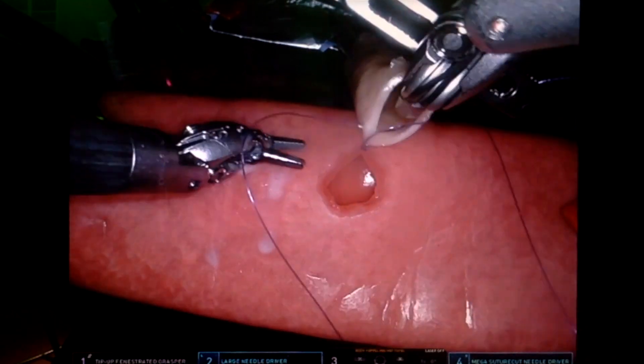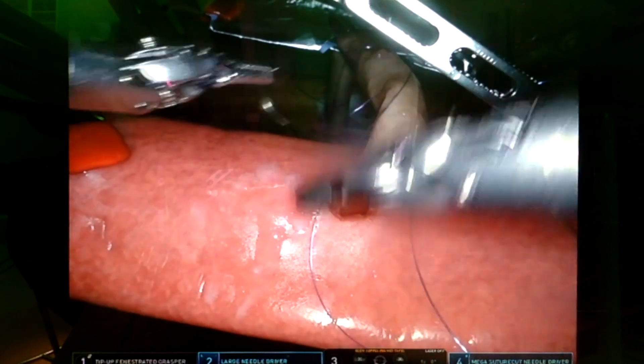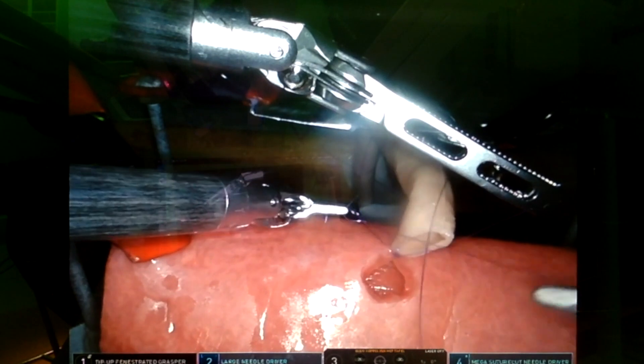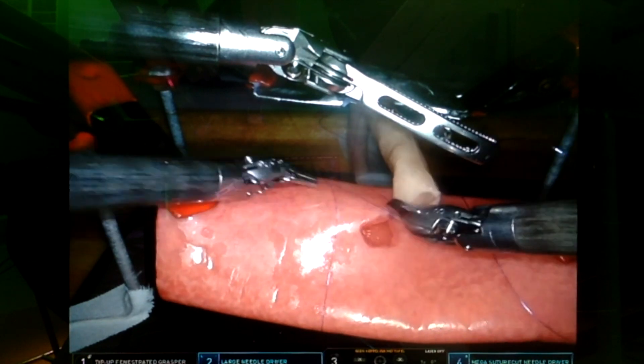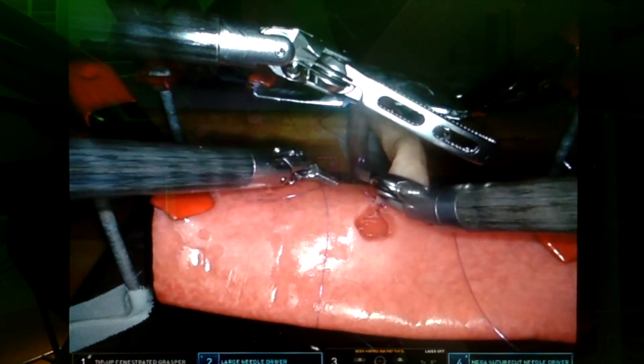First we anchor two monofilament sutures, for example a 5-0 PDS suture. We use a small half-circle needle. With these vulnerable sutures, it's very important to minimize suture contact. As soon as the sutures are anchored, the additional robotic arm can enable the exposure and stabilize the anastomosis.